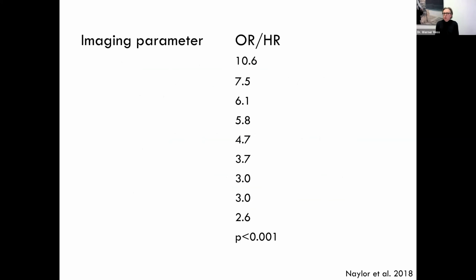Well, I promised you that I would come back to the paper I mentioned before, and I have changed the table. What I did is I sorted the different ancillary methods according to their odds ratio. So the higher the figure, of course, the better the predictive value. And I left this open and give you a moment to think about it. So which method, MRI, CT, ultrasound, TCD, MES monitoring, autoregulation, is the best to predict whether a person with asymptomatic carotid artery stenosis will get symptomatic?